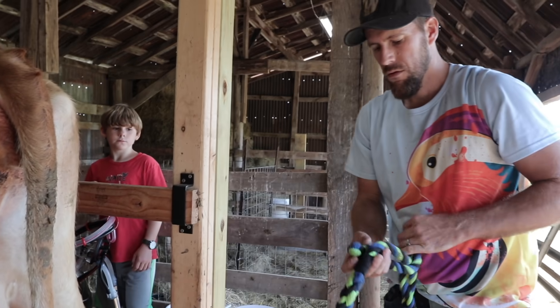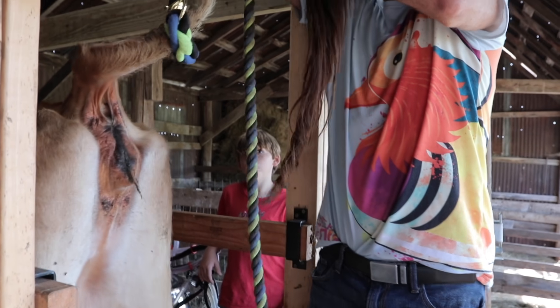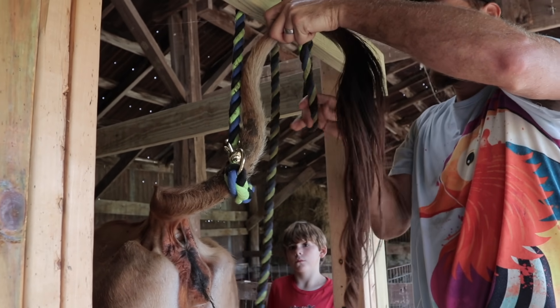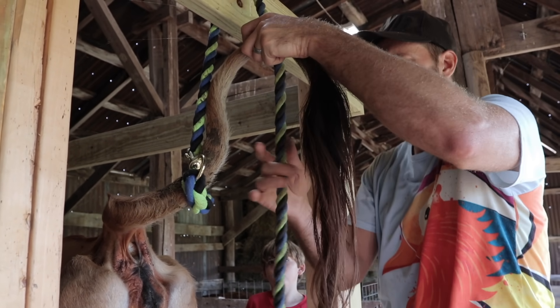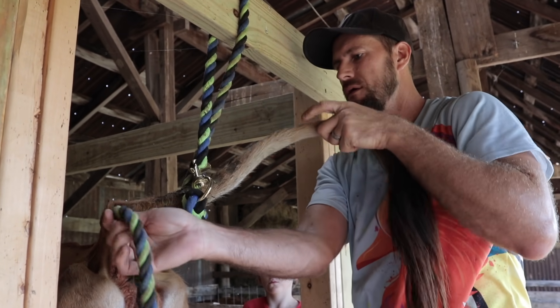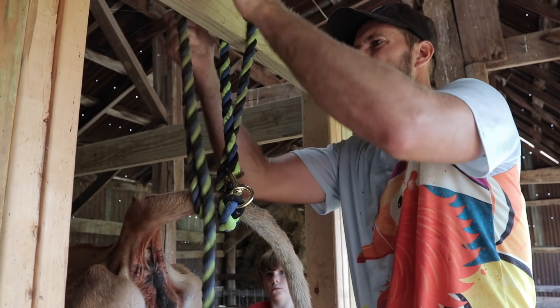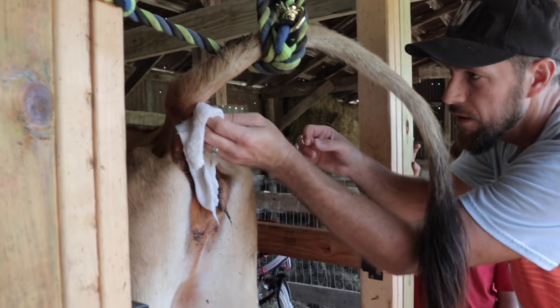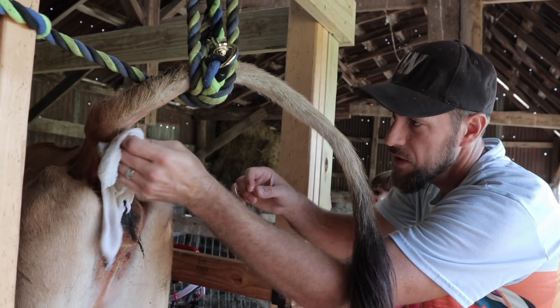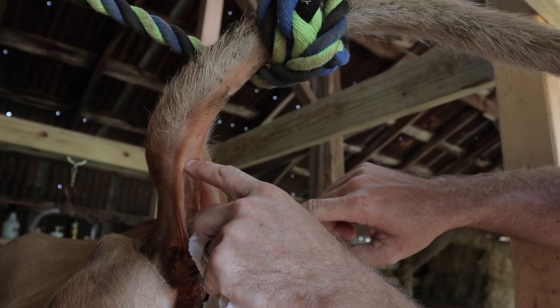This is also the most intimidating way for most people, and for us too, because this is new to us to draw blood. We'll see if we can figure this out. You can draw blood from behind her tail, but it's very difficult because they have a strong tail. There's a little triangular shape right here, and right where it comes together is about where I want to stick to try to hit the vein.